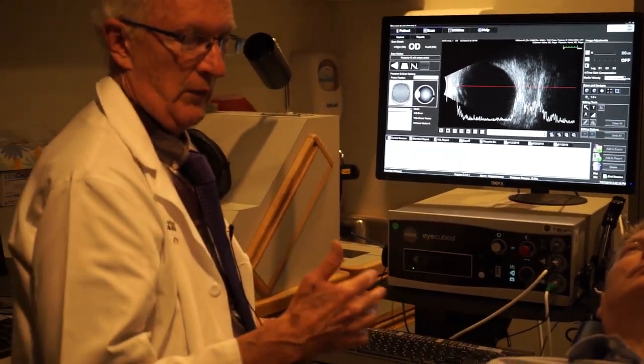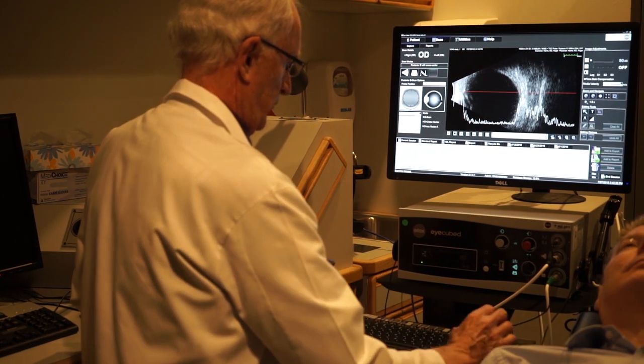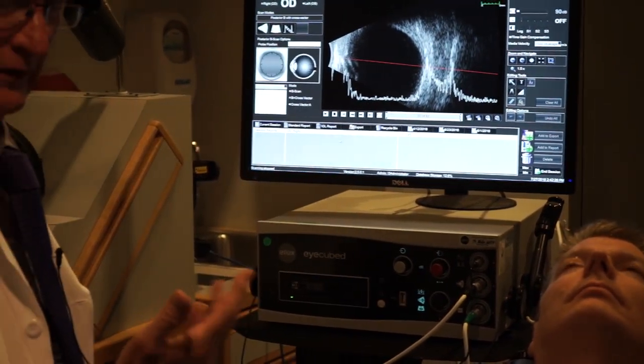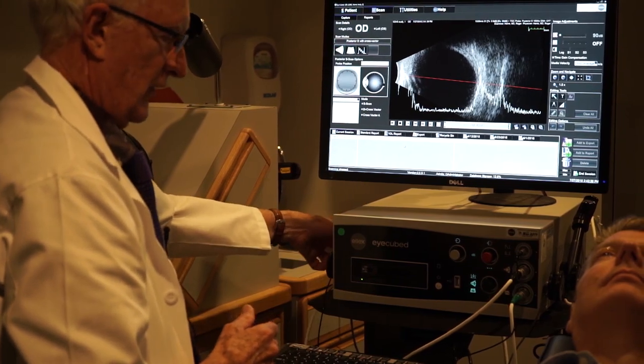Occasionally, if there's a staphyloma and I want to measure an axial length, I can use the vector to find the staphyloma and then measure for an axial length — but again, that's not very often. So that covers A and B-Scan techniques.